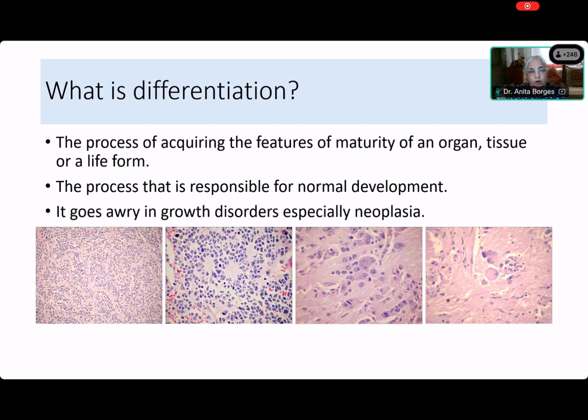Aradhana, do you agree? All these pictures are related to one another. There are small round cells, there are rosettes. Now somebody's saying that there are squamous cells and mucin. Does that make any sense to you, Aradhana? Small round cells, rosettes, and then squamous and mucin? Does it make sense to you? Spindle cell. Spindle cells. Can you point out a spindle cell to me, please? Now you know how to get annotation. Lots of people have got very good ideas in the chat box, and they're correct. Very good. I approve. Come on, now show me spindle cells.